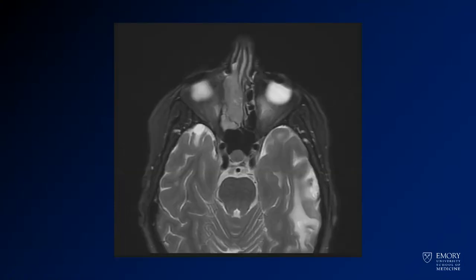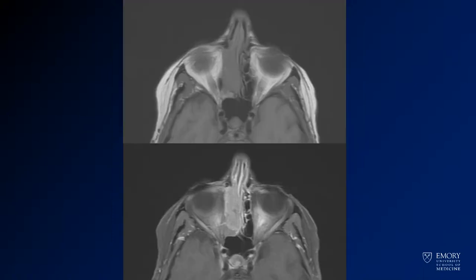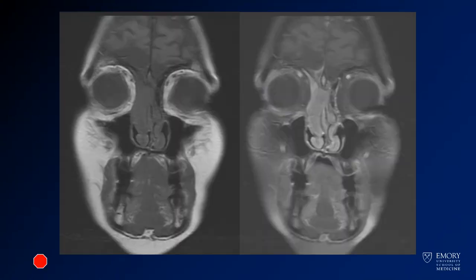Now we have an MR through the same region. This is the T2 fat-sat MR. Here you have pre and post contrast through the same region, and now coronal pre and post contrast.